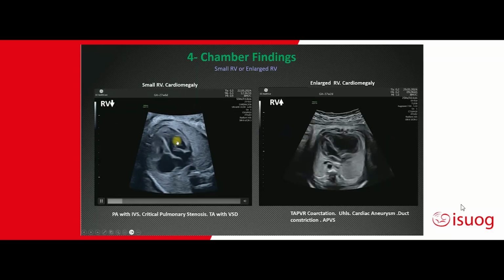Next, we move on to this case of a four-chamber view of the heart, and we look at the size of the heart. The cardiothoracic ratio should be less than 50% according to the ISUOG guidelines, and you can see, in fact, this is more subjectively. They had 60%, but you measure the circumference of the heart to the circumference of the chest.